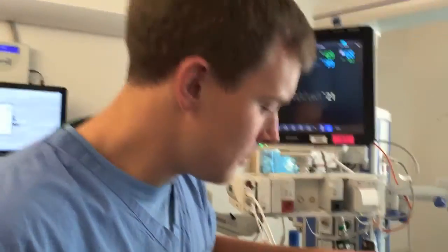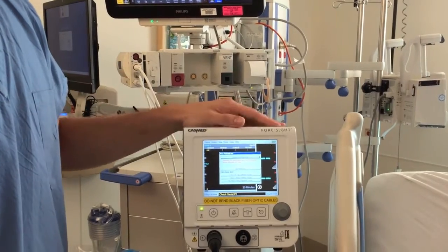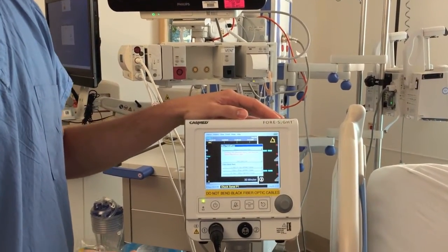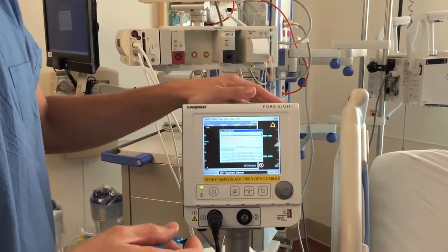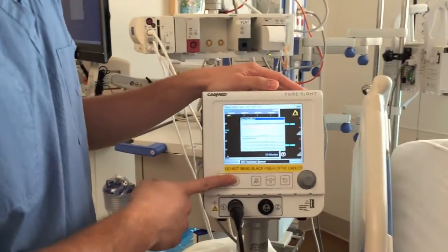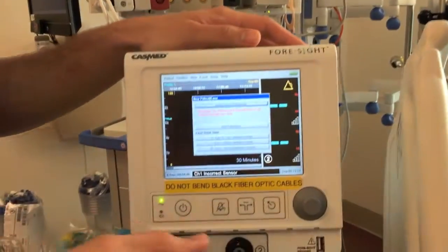Today we're going to be talking about the NIRS monitor and going through the setup for the monitor itself. The NIRS can be found in the 7 Southeast equipment room. You bring it to the bedside, turn the monitor on, and it'll go through its own self-check and bring you to the new patient screen.